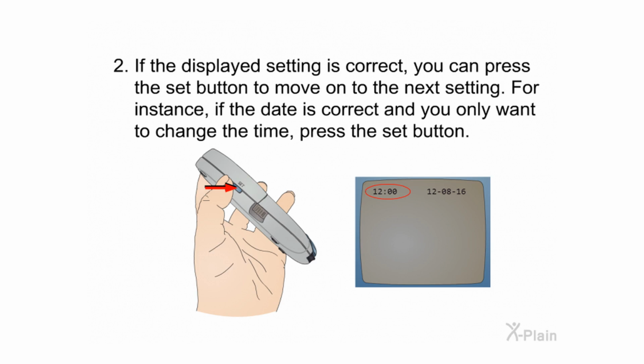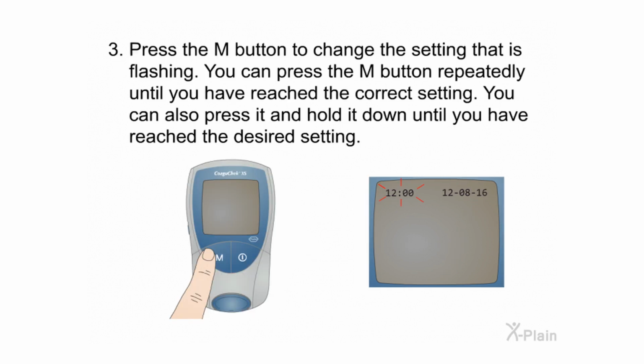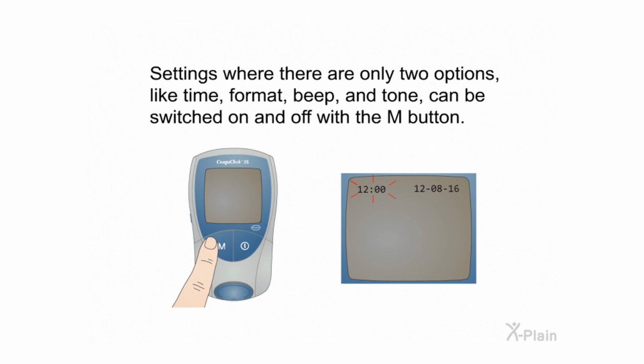2. If the displayed setting is correct, you can press the Set button to move on to the next setting. For instance, if the date is correct and you only want to change the time, press the Set button. 3. Press the M button to change the setting that is flashing. You can press the M button repeatedly until you have reached the correct setting. You can also press it and hold it down until you have reached the desired setting. Settings where there are only two options like time, format, beep, and tone can be switched on and off with the M button.